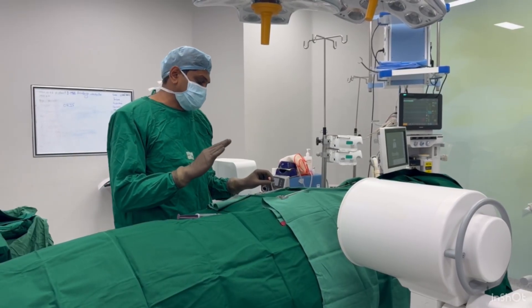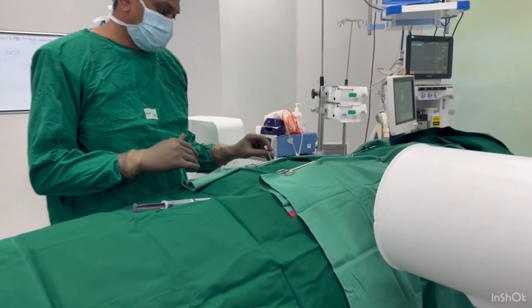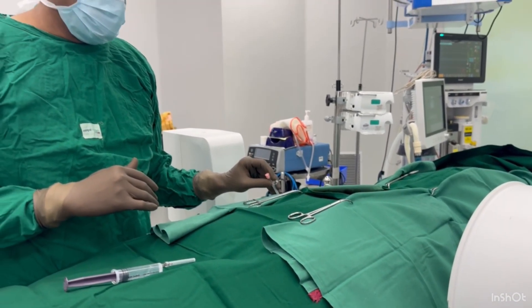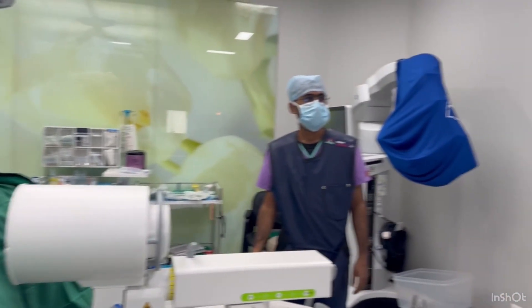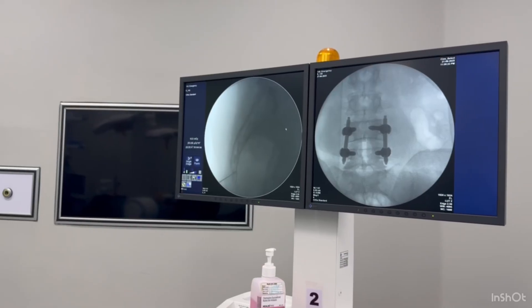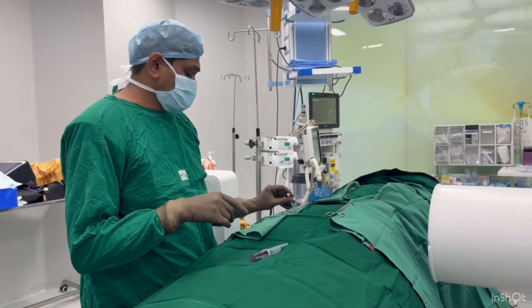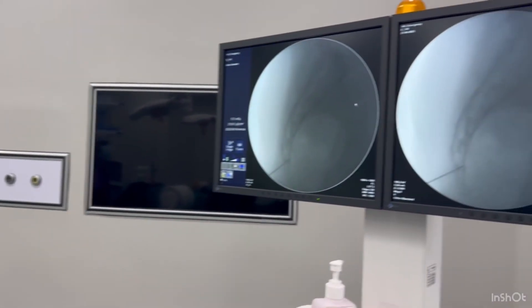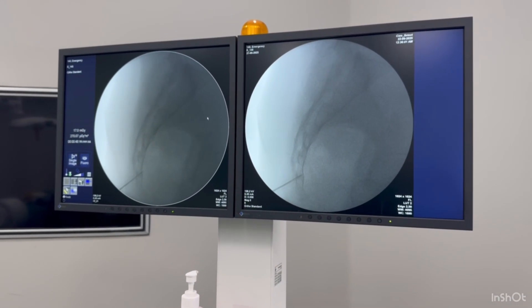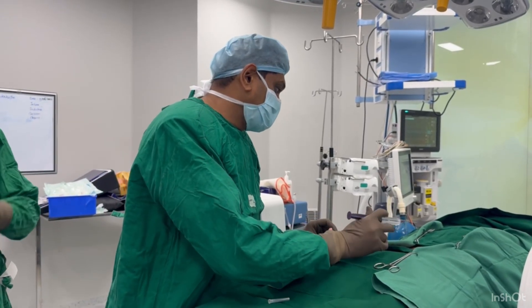This is the lateral view of the sacrum area. We are going to check with the needle the exact location on the sacrum. We are now going to do the local anesthesia at the site, and we are doing the local injection.